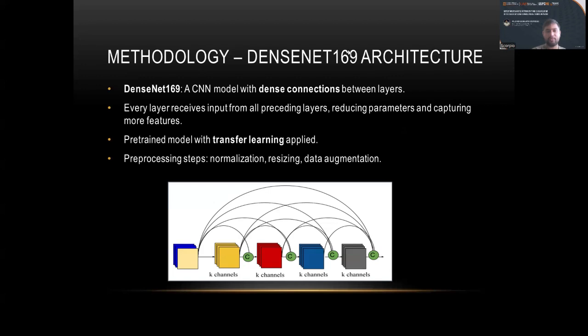This allows the model to converge more quickly during training, as it prevents large variation in pixel values from overwhelming the learning process. Data augmentation. To improve the model's generalization ability, we apply data augmentation techniques.